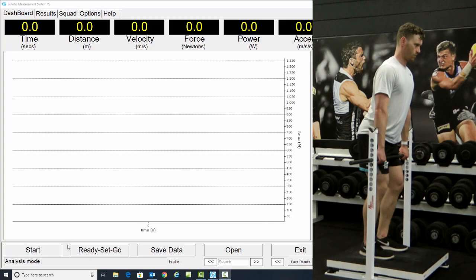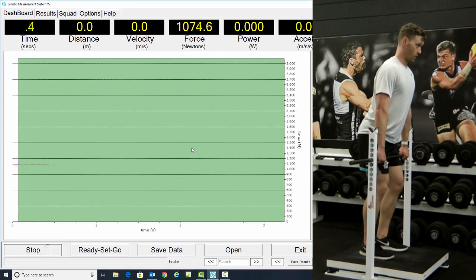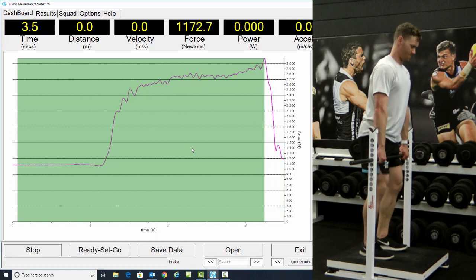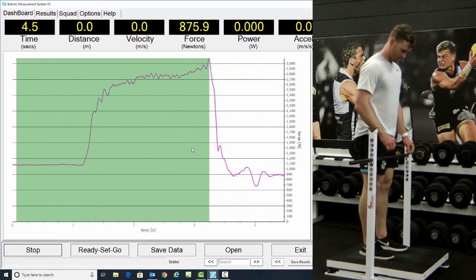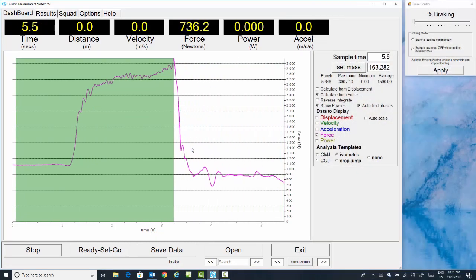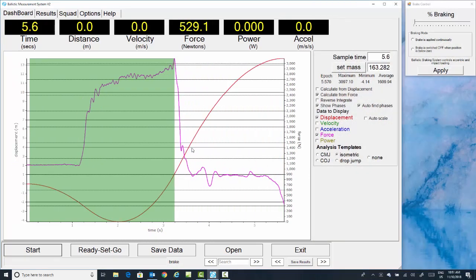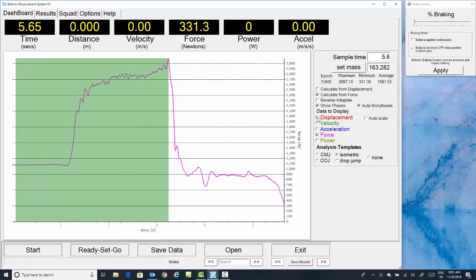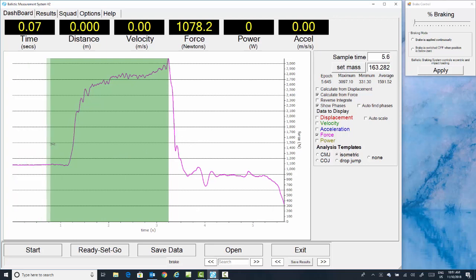Now we have the isometric exercise. In this case it's a mid-thigh pull. So we want to select from the start of the exercise to peak force. In this example we need to move the start of the exercise due to movement after completion. So we click and drag, and now we have the whole sample collected.